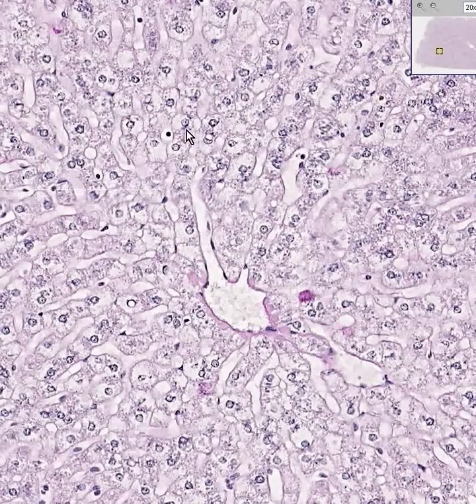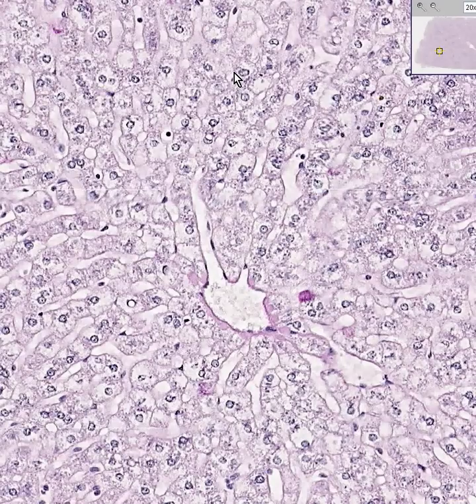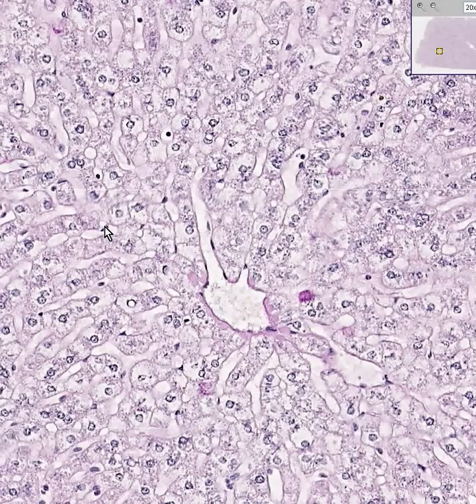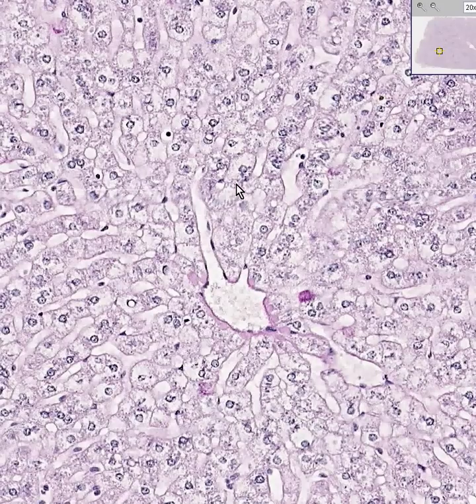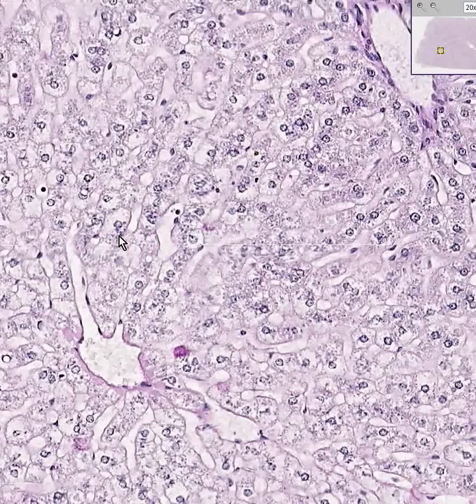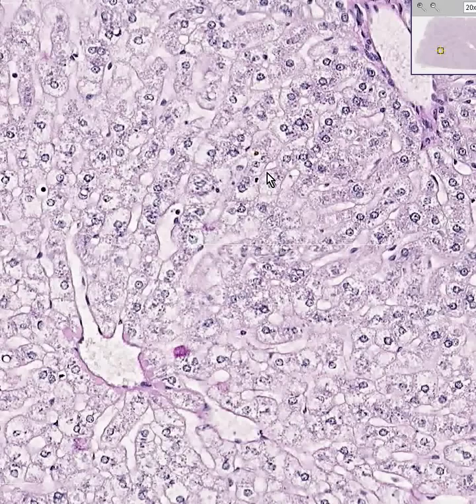Whereas every single round nucleus here is a hepatocyte, if you see something a little spindly — like here, or here — these are going to be the macrophages of the liver, which are called Kupffer cells. Except for the portal veins and central veins, everything in the liver is either a Kupffer cell or a hepatocyte.